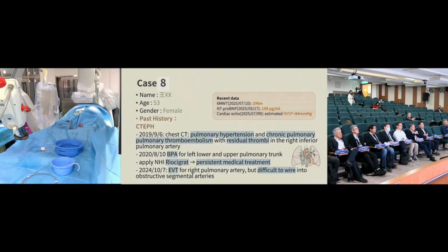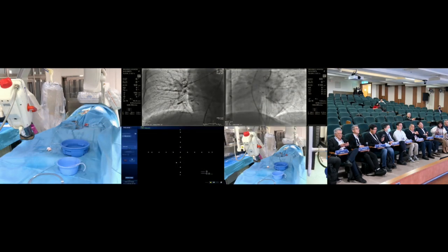So it's a type E lesion. This is a very high-risk patient for BPA and could potentially have very serious complications such as hemoptysis during the procedure. So our strategy today is to take a more conservative approach for the treatment of this patient, so maybe we can find some treatable lesions to treat later on.